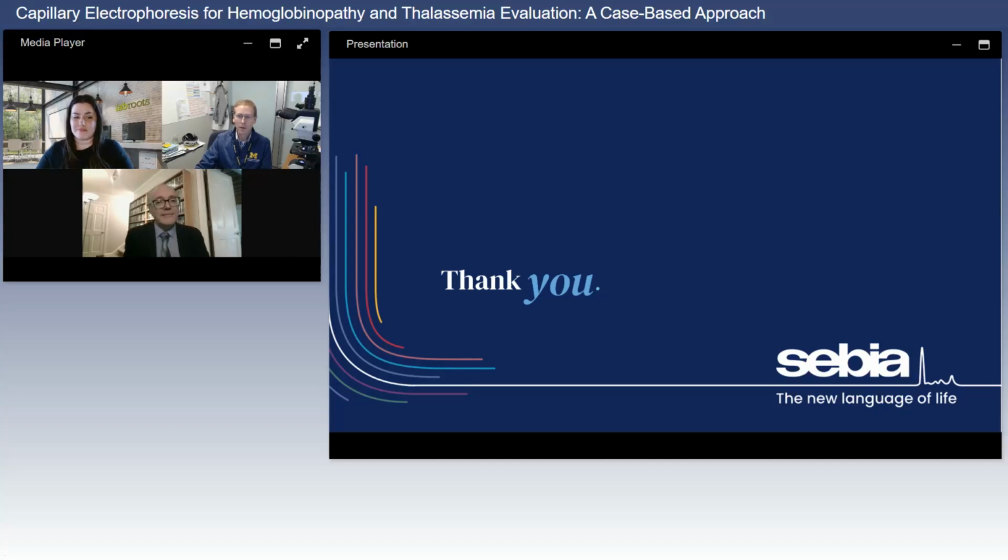Yeah, I think so. And just to make sure everybody's really clear on this point, we're not quantitating these hemoglobins. So it is all a relative amount of the entire hemoglobin. So yes. There are some complications to that question depending on treatment and concomitant thalassemia, et cetera.